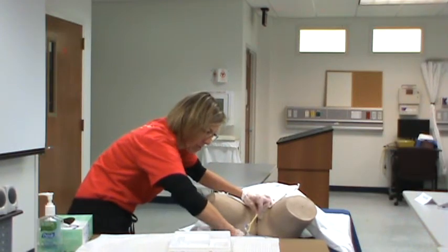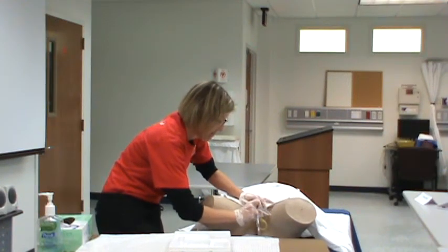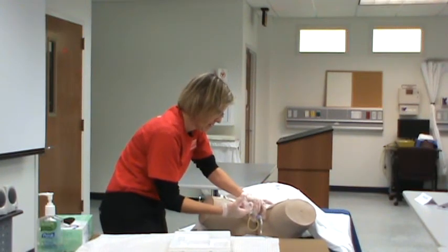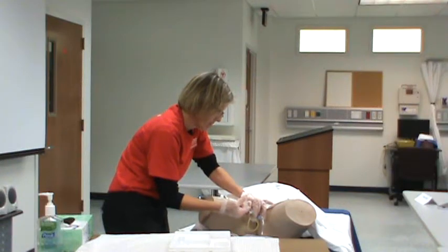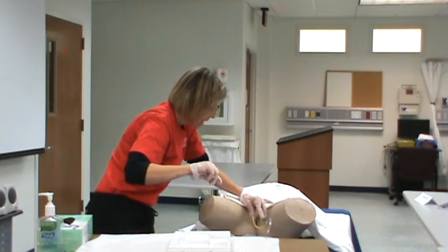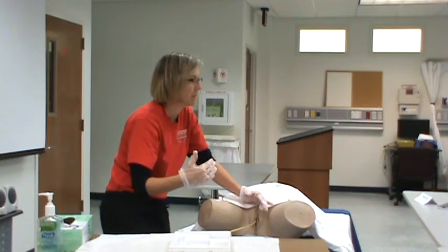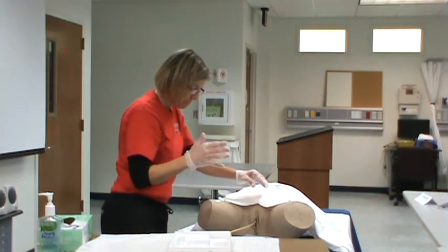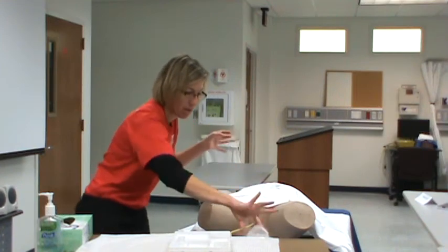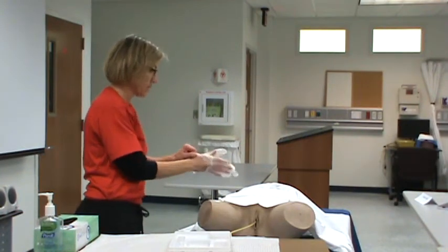And so since my syringe didn't stay, I'm going to adapt a little bit by being fancy here. And then you inflate the ball, like so. Okay, it will fall back a little bit on a real person and even on the mannequins. It'll fall back a little bit, that's totally fine, okay? Now I'm kind of ookie and gookie, so I'm going to take these off and put clean gloves on and secure the catheter. At this point, Mrs. Smith, she had a full bladder.